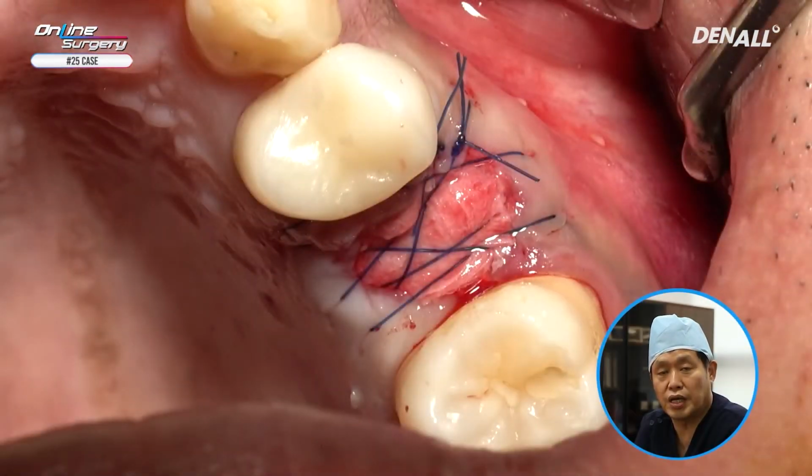If collagen membrane is exposed like this, this part will be resorbed and the bone graft superior to that will be resorbed, but this was done to maintain the buccal bone. Immediate implantation after extraction has been demonstrated.